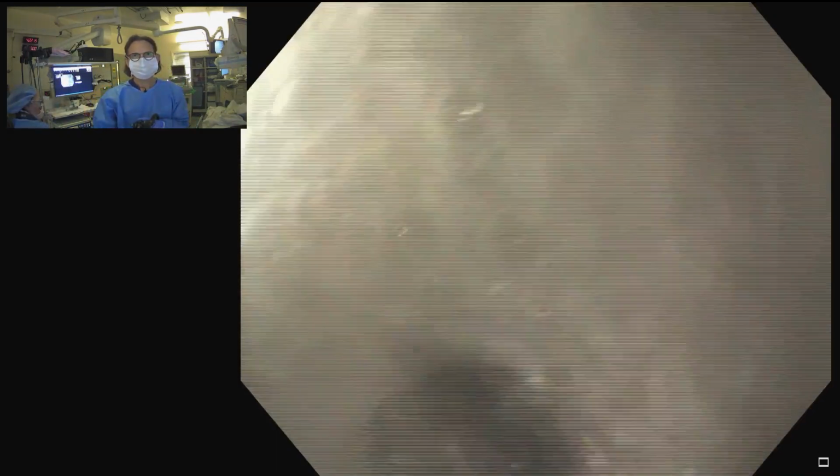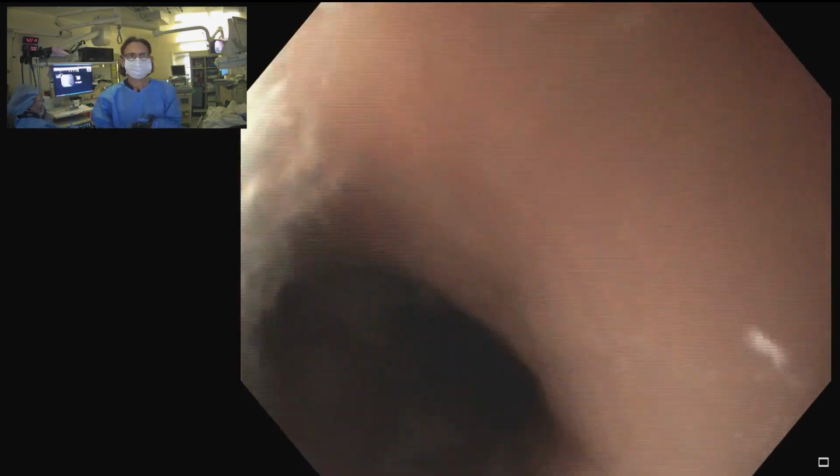One thing I do is, usually the medical or surgical teams are worried that you'll inject and the fluid will accumulate inside the cavity. Yeah. Show them communication. So the blue color is nice. You take a picture. Tell them they're communicating. So whether you inject, it's going to come up.